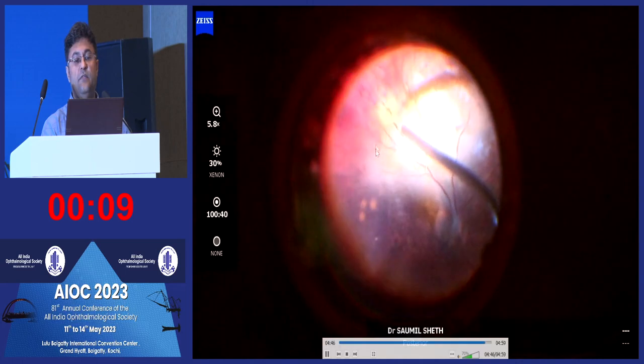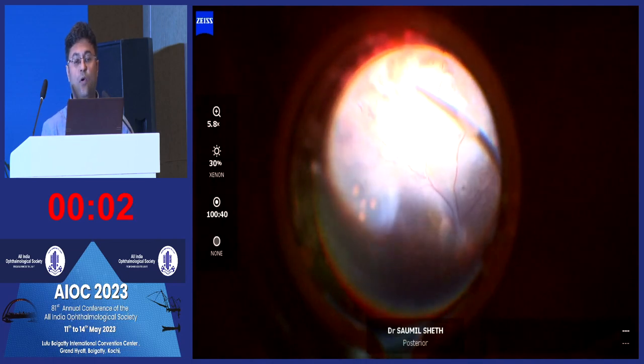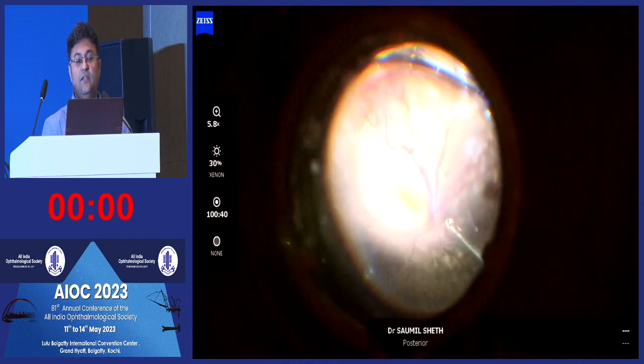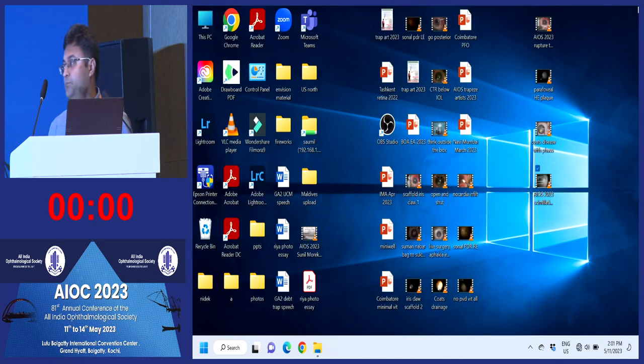This is a cyst here which we have deroofed, and then we laser all the telangiectatic vessels. It is essential even to laser the ischemic retina beyond, for fear of causing NVI. There is no PVD here, yet despite that, we do an air fluid exchange to fill up the space. And this was an important last step wherein we put Avastin at the end so as to close the remaining telangiectatic vessels. Thank you.